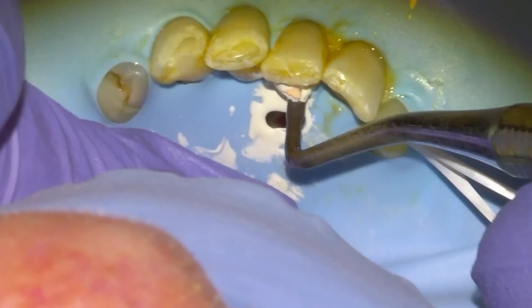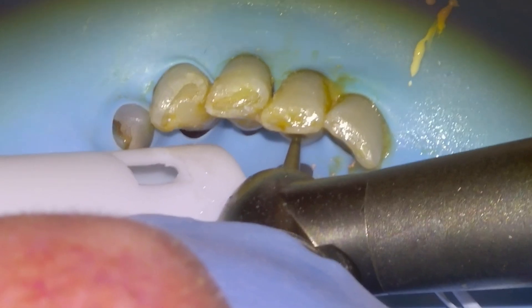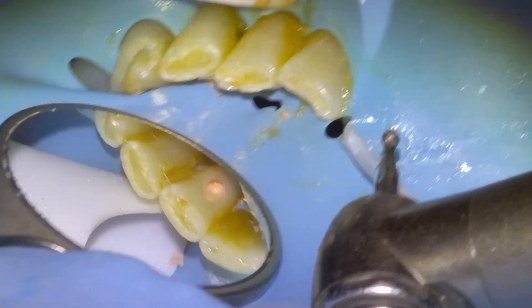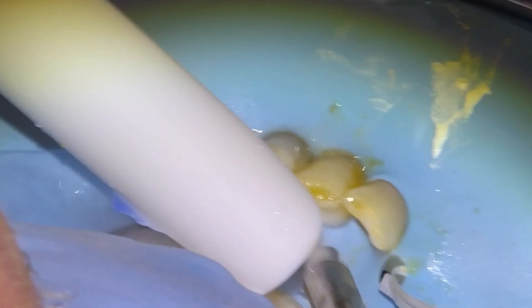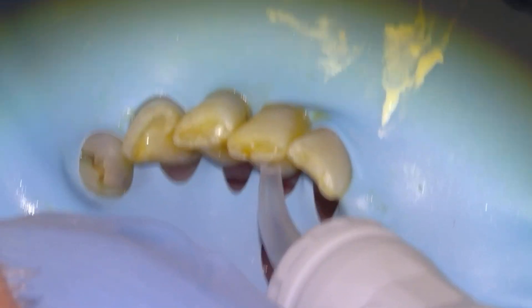Then take it down a couple millimeters with the round burr before we restore the access. We'll restore with Equia Forte — etch for five seconds, rinse, dry, and then fill up the access cavity with the material.